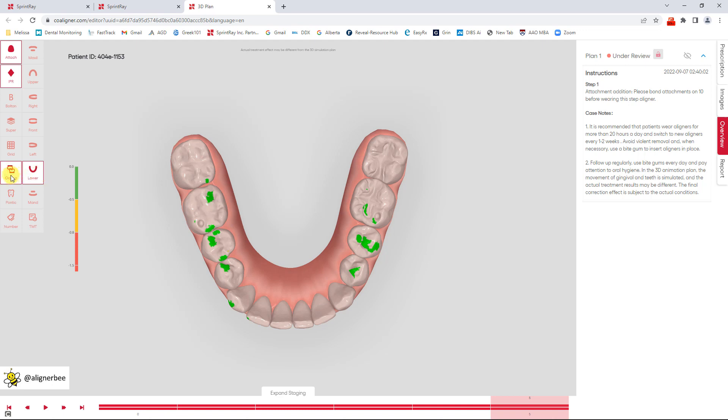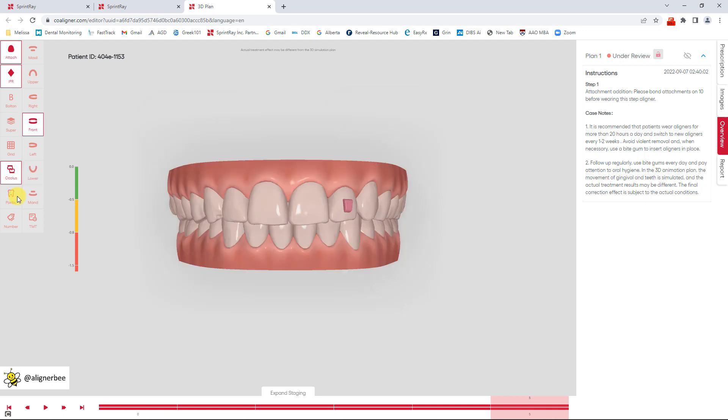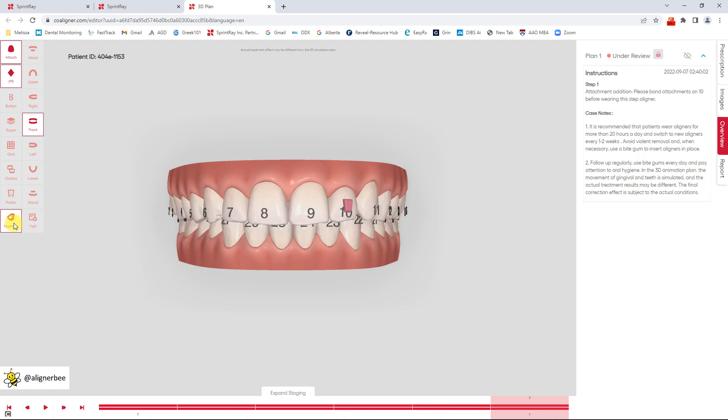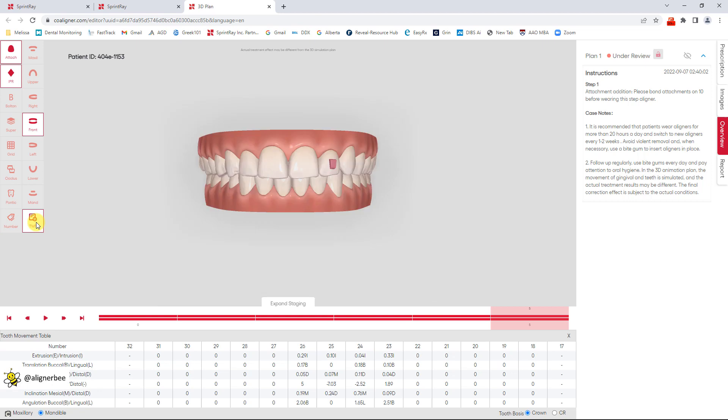In this case, I don't have any pontics. However, if I did, there is a function to see the pontic. I can click on the tooth number and it's going to give me the tooth numbers in universal numbering system. And if I click on the tooth movement table, it's going to give me all of the movements of the teeth.